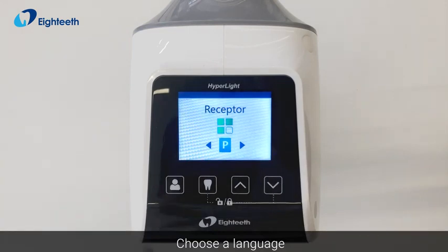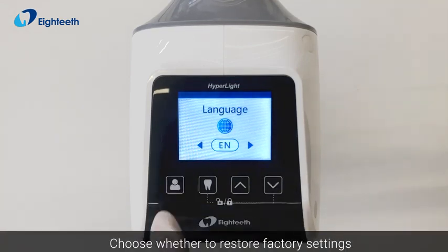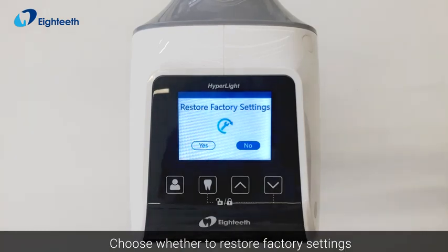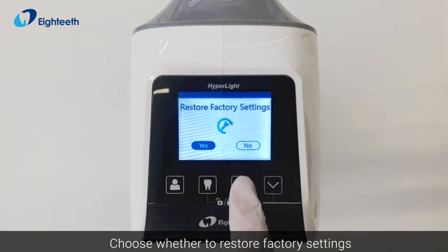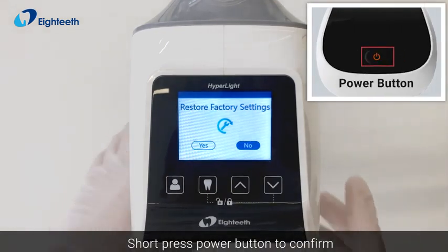Choose a language. Choose whether to restore factory settings. Short press the power button to confirm.